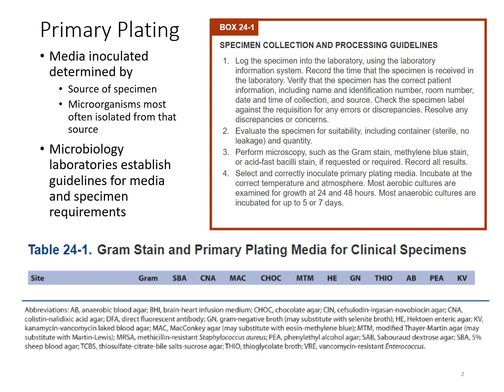Now, once you have the sample and that first step has been performed, then of course you're going to evaluate your sample for the quality of it and make sure it's suitable for the particular culture that has been ordered, making sure that the sample has not been contaminated in any way. For example, urine containers, a lot of times patients or staff don't properly seat the top on that urine container, so it's sitting on it a little sideways, and the urine will leak out into the transport bag.